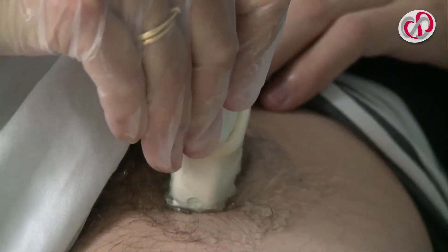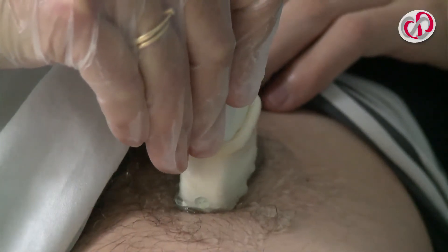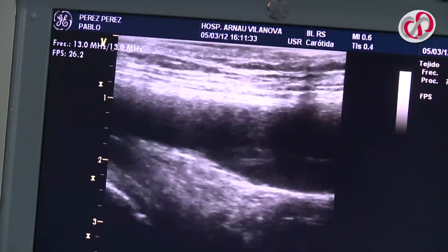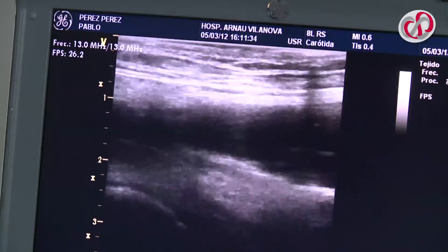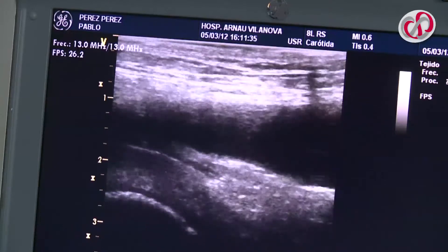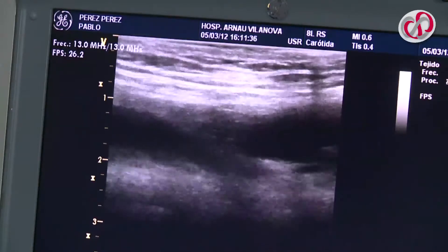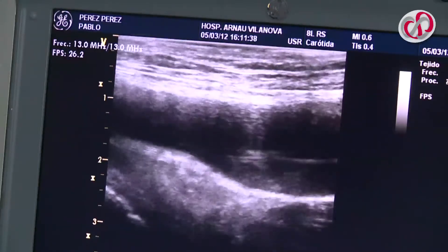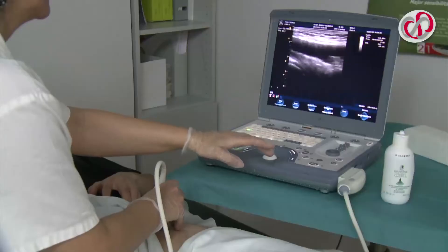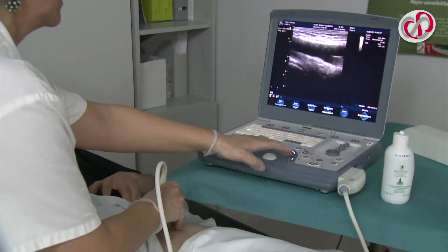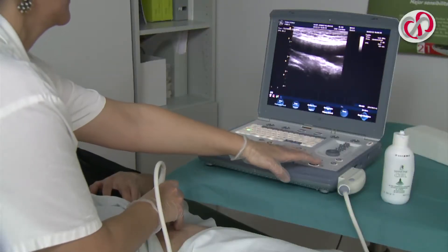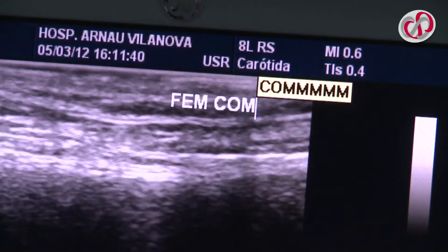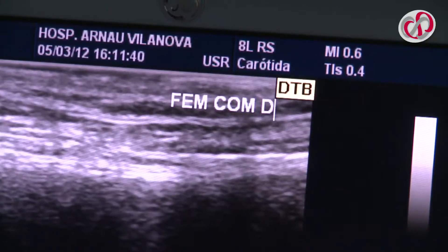At the level of the bifurcation, the probe is rotated to a longitudinal position until a good image of the common femoral artery and bifurcation is obtained. The image is captured, correctly identified and saved.